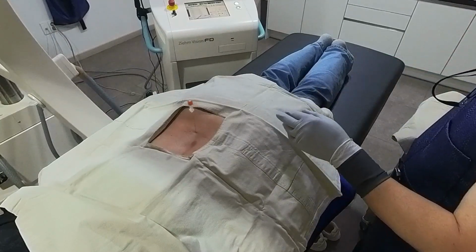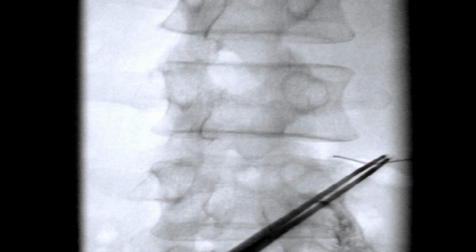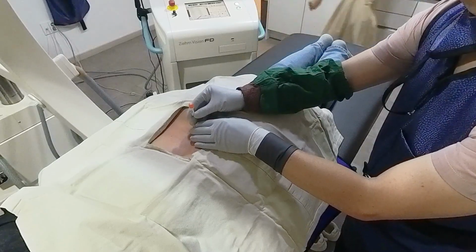Then, I will move on to the right L3 infraneural retrodiscal approach, the real pain generator site. I will approach the needle in the same way. Enjoy the show.